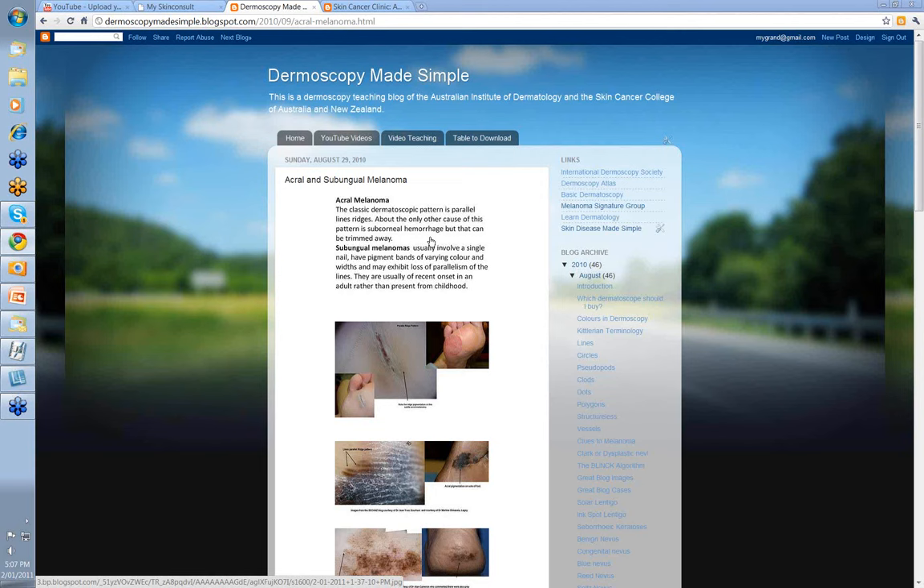A subungual melanoma is probably part of an acral melanoma. It usually just involves a single nail, so one nail that's involved. You don't have pigment lines going down several nails. When you look at this nail, they'll have pigment bands of varying color and width — parallel to each other, varying in color, varying in width — and there may be some loss of parallelism, where the lines converge. Remember, they're usually of recent onset; you haven't got a line that's been there for 20 years. And it usually occurs in adults rather than something present since childhood.